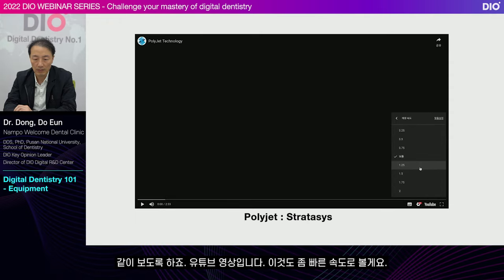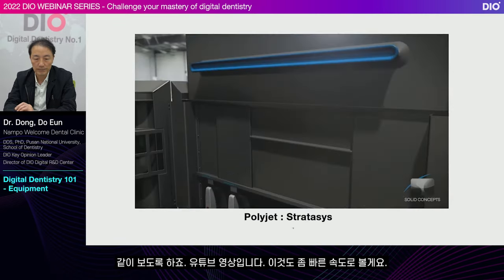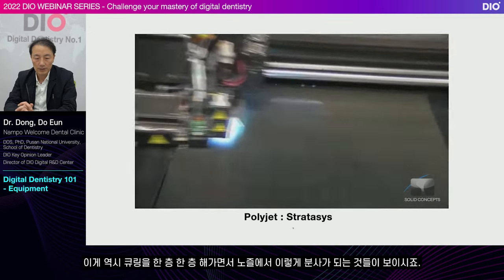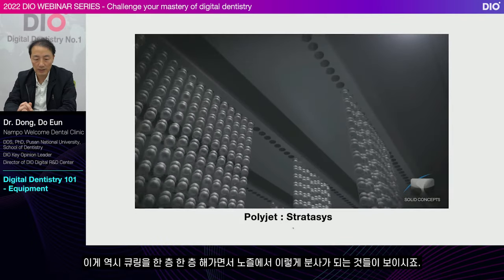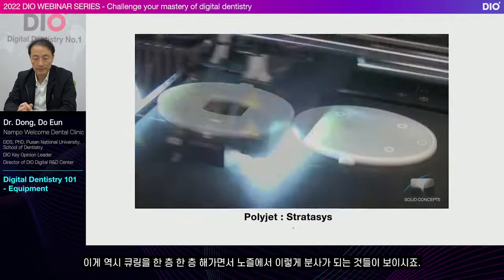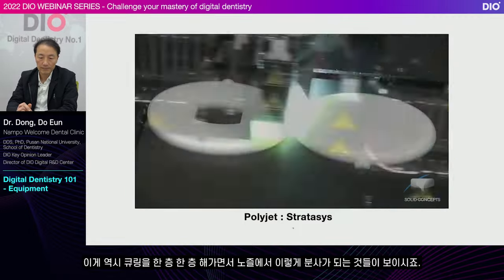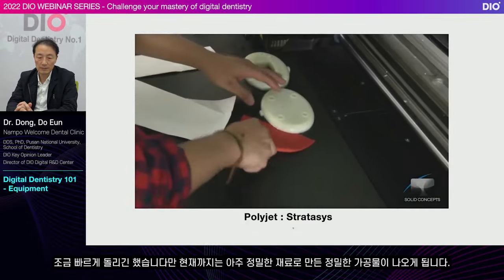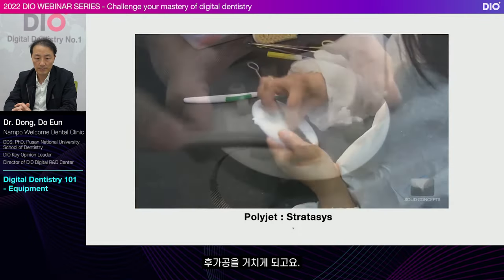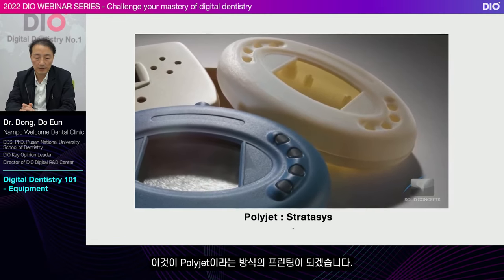I'll increase the speed again. It cures one layer at a time, and you can see that it sprays out from the nozzle like this. I did speed it up quite a lot, but it produces a very precise end product made with very precise material. It goes through a post-treatment. This printing method is called polyjet.